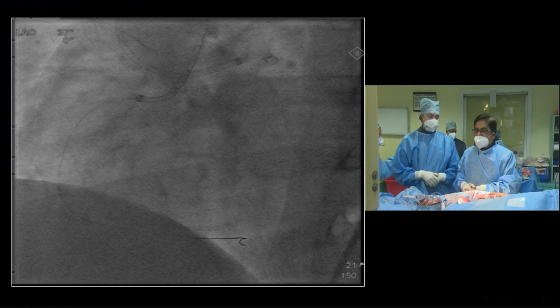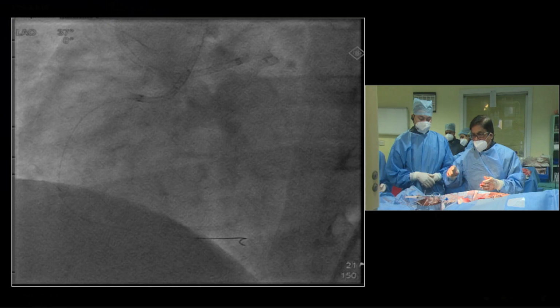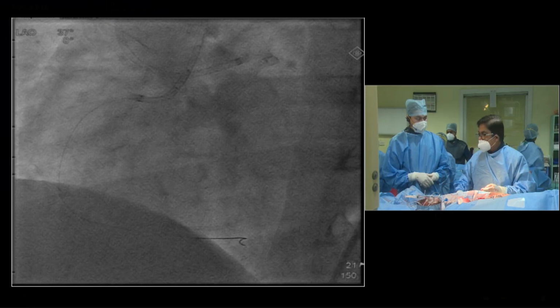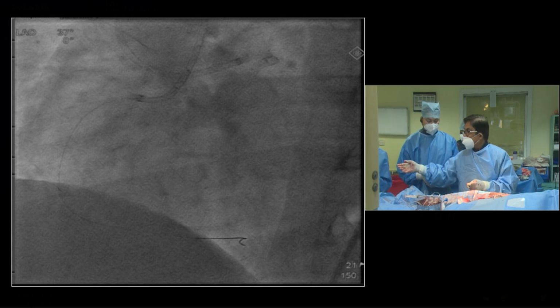You are asking Pratap. Pratap, you address that. My thought was the one around the apex is too long. The length is also important, because if I am just left with the hub of the microcatheter to go inside, if I use a very long channel, then that microcatheter also falls short sometimes. This is actually the problem with the around the apex microchannels.